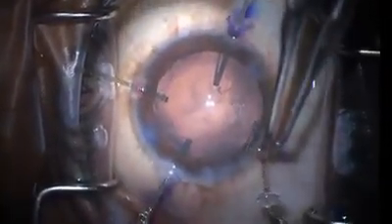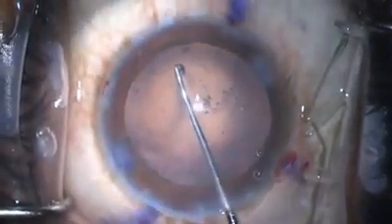So now we've placed the capsular tension ring. We can remove the MST retractors, and the lens capsule is pretty stable. You can see we tweak on it a little bit, and it's pretty stable. So we think we can use traditional optic capture.